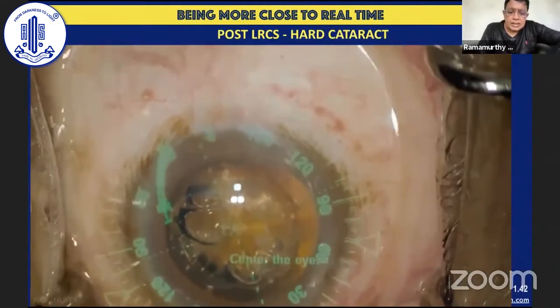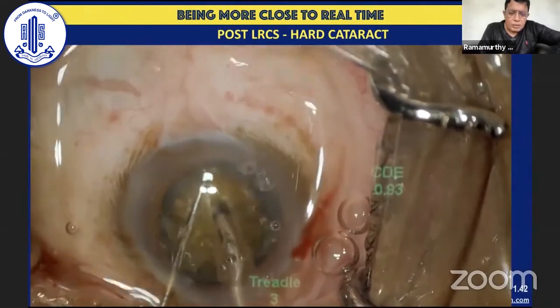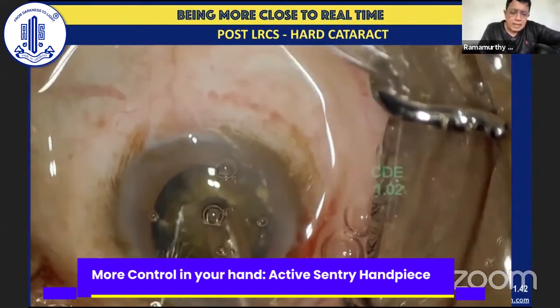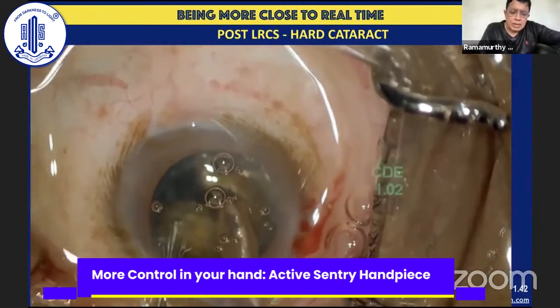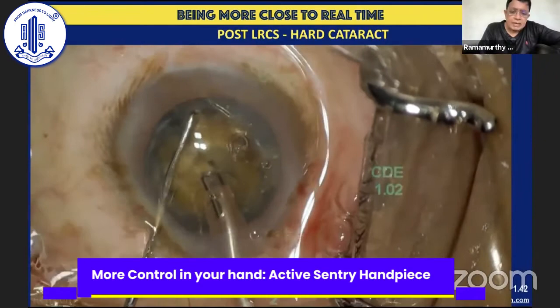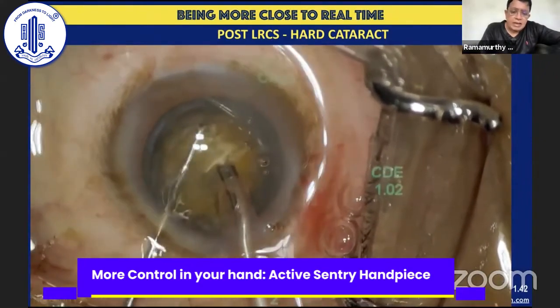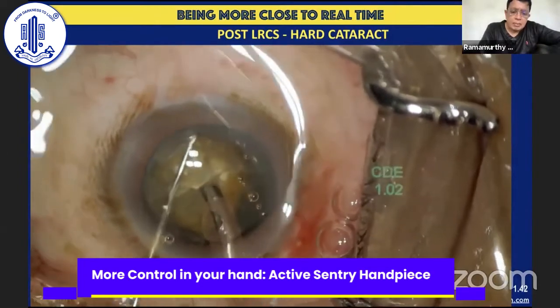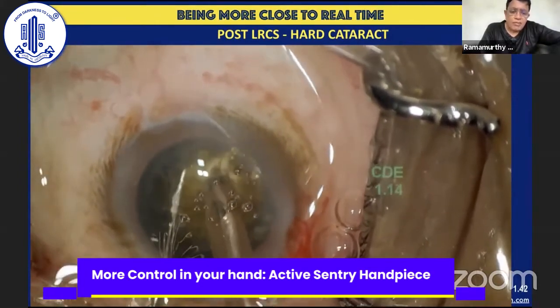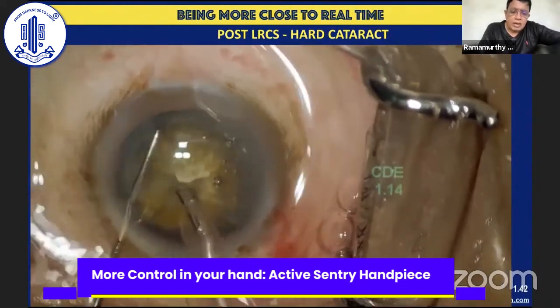Both the segmentation as well as softening of the nucleus has been done. What I do with my phaco tip is to essentially make a small groove and then subsequently do the chopping along the lines which have been created with the laser itself. Each time I basically bury into the meat of the nucleus by going into the initial trench that I had created. I often find that it helps me, especially in the harder cataracts, to get a good grip onto the nucleus.